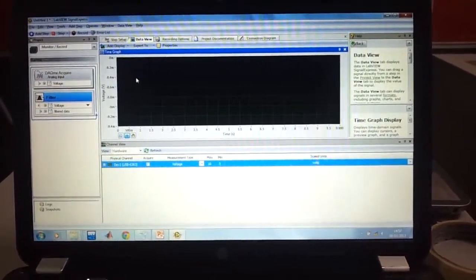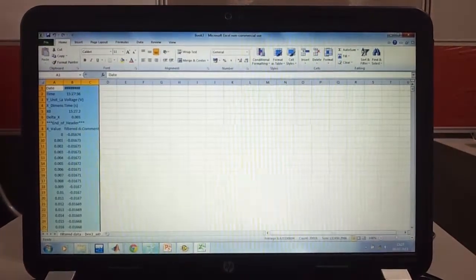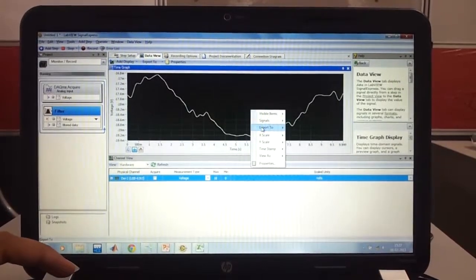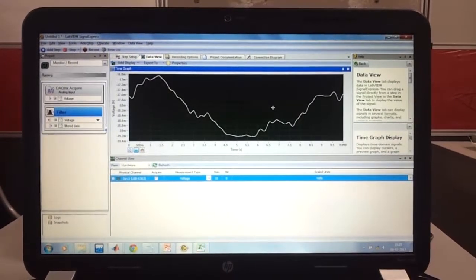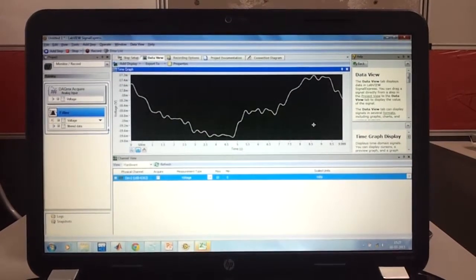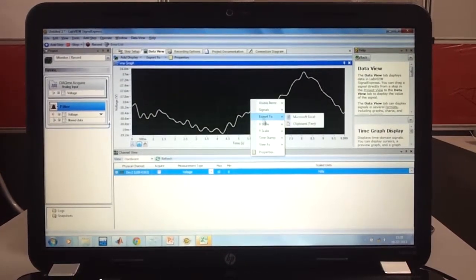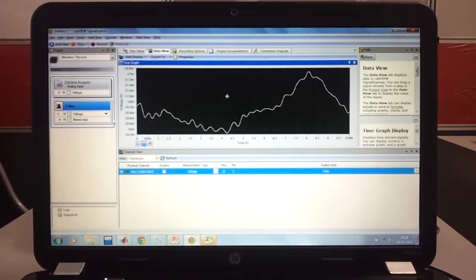Now you can see the signals from the electrodes, which I am exporting to Microsoft Excel, where these values are stored. These values are stored depending on the time, the number of samples, and the value, that is the amplitude of the sample. Here you can see I am taking 10-second frames. The value keeps changing for every 10 seconds, and these 10-second frames are being stored in Microsoft Excel.